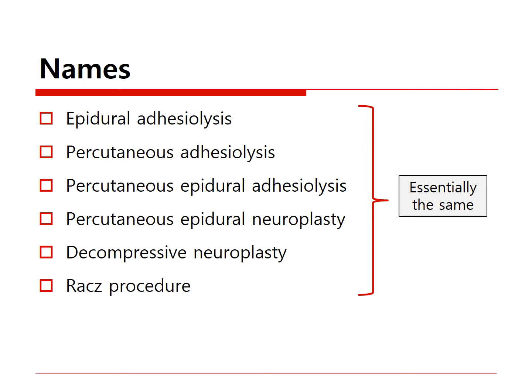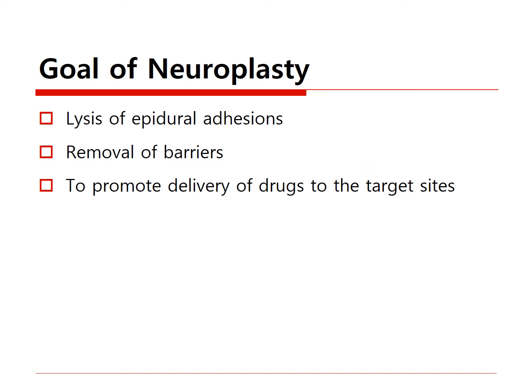Recently, many physicians call this technique by various names, but they are indicating the same procedure. The goals of epidural adhesiolysis or neuroplasty are lysis of epidural adhesions and removal of barriers to promote the delivery of drugs to the target sites.